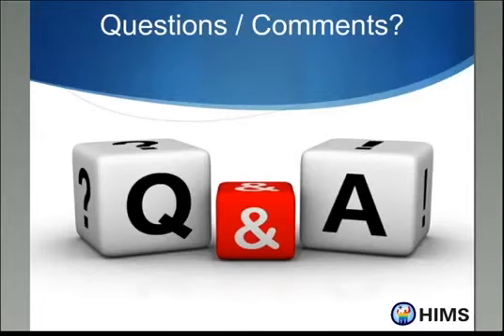There are a few more questions that came through. And Diana wants to know, are you able to add daisy tags to a pre-recorded file? If the file is already created, I can't go back in and add daisy tags to it. No. That'd be pretty cool.